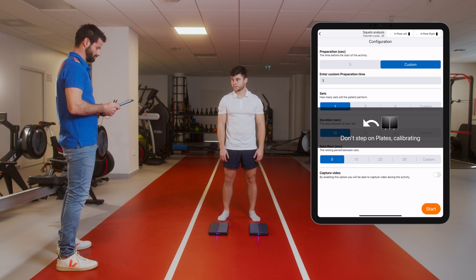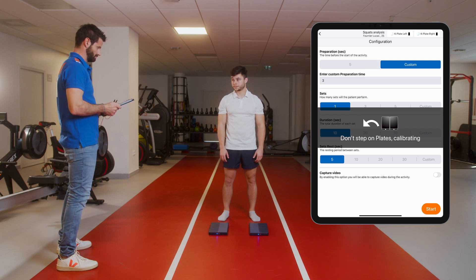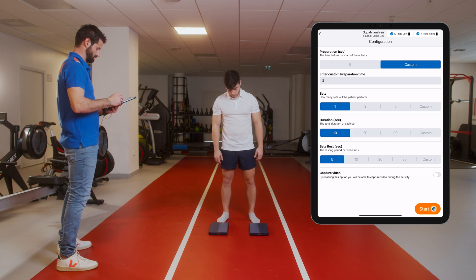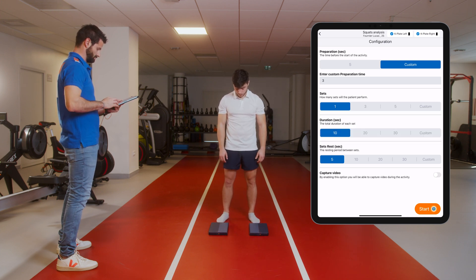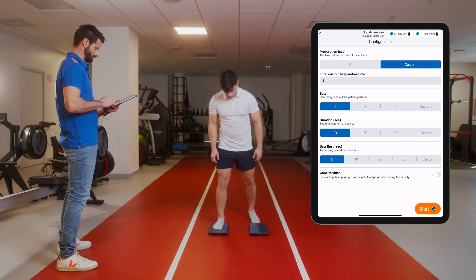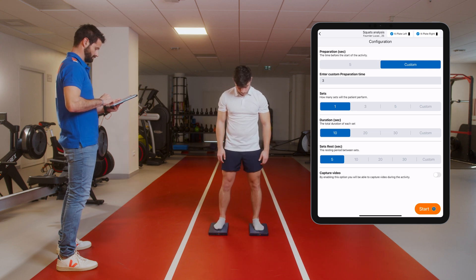Start them and make sure the light is green. The plates are placed correctly and the light is green. We will start the test. The plates will connect to the tablet and the light will turn blue.